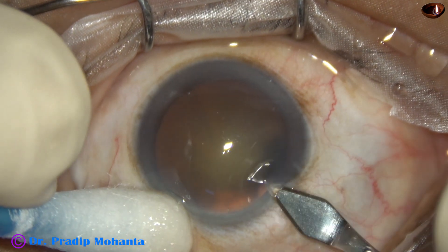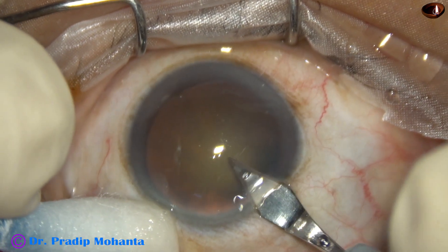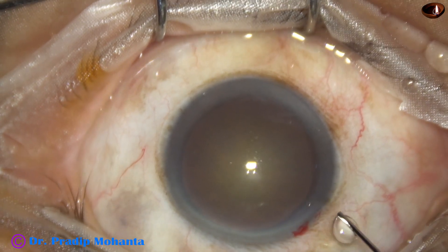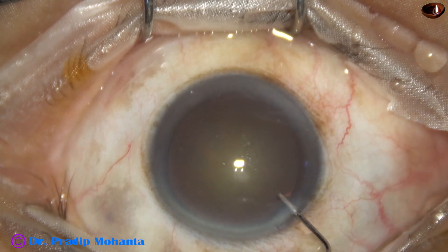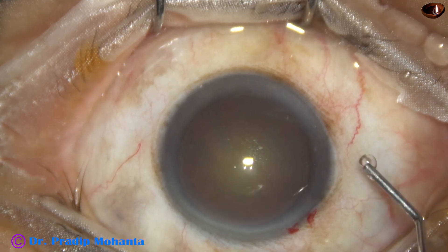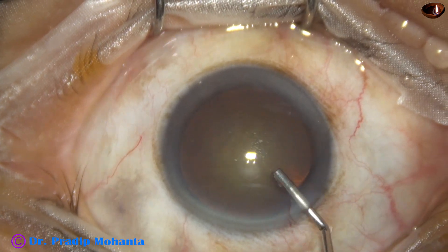This is the main incision with a 2.8 mm steel keratome. On the posterior aspect of the limbus, there is some oozing of blood. This is phenocaine, which contains lignocaine, tropicamide, and phenylephrine.